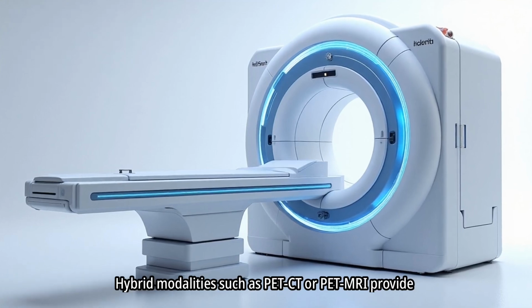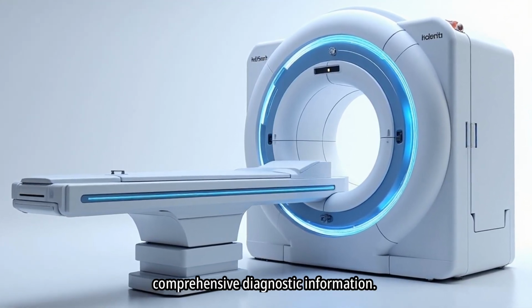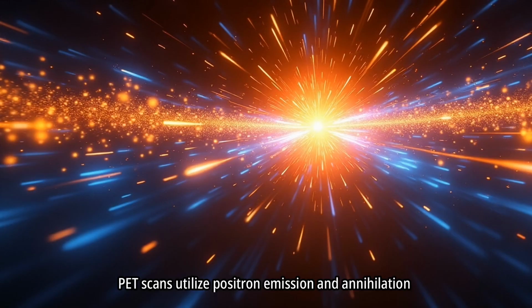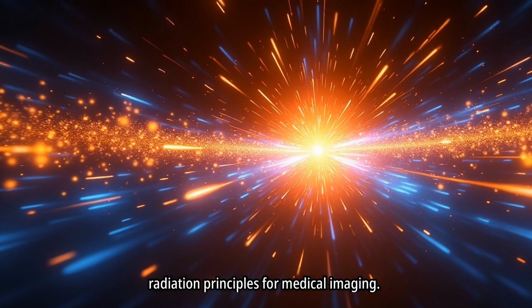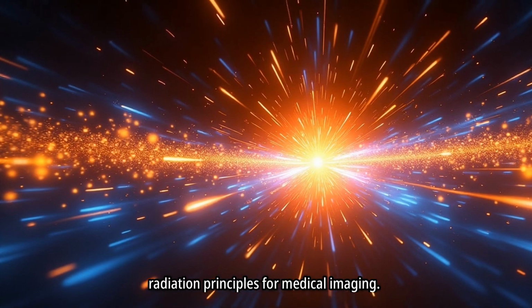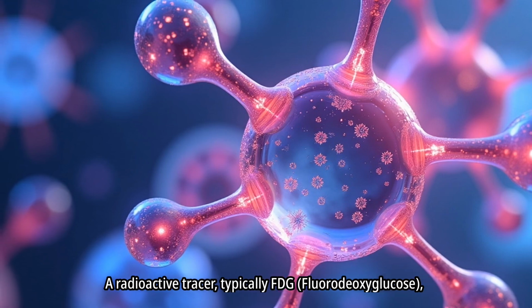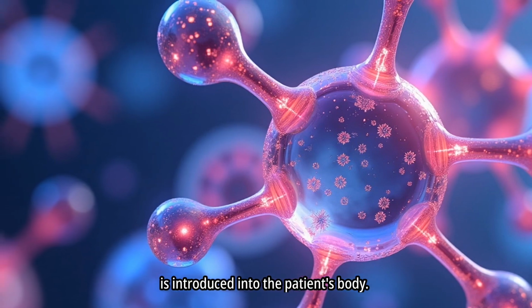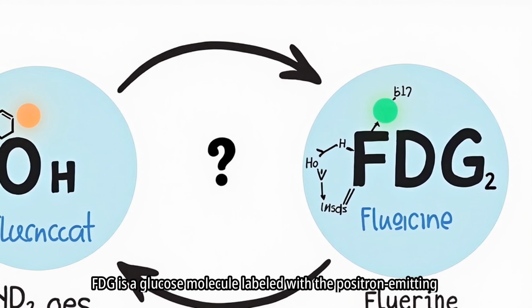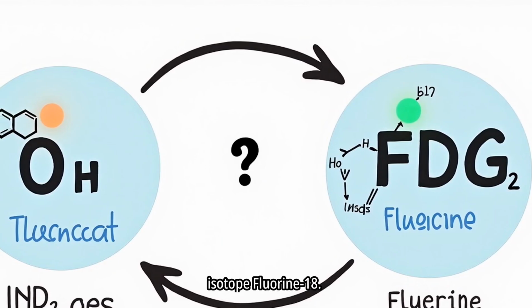Hybrid modalities such as PET-CT or PET-MRI provide comprehensive diagnostic information. PET scans utilize positron emission and annihilation radiation principles for medical imaging. A radioactive tracer, typically FDG, fluorodeoxyglucose, is introduced into the patient's body. FDG is a glucose molecule labeled with the positron-emitting isotope fluorine-18.